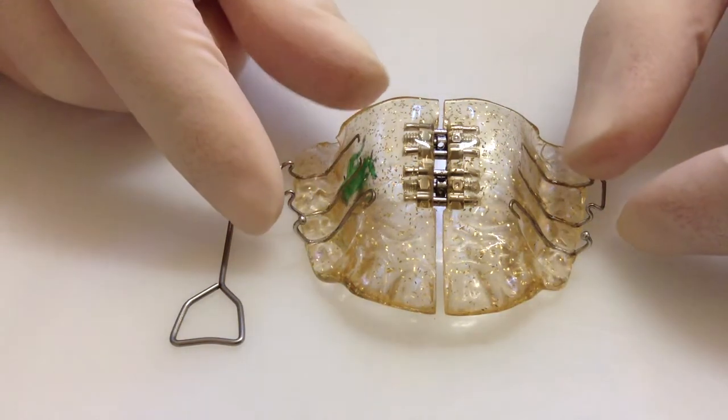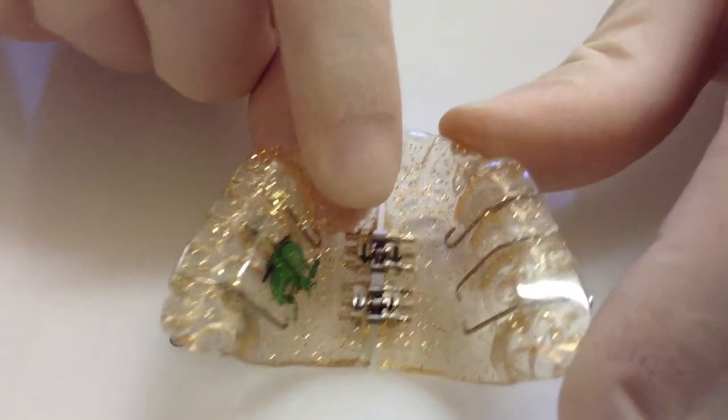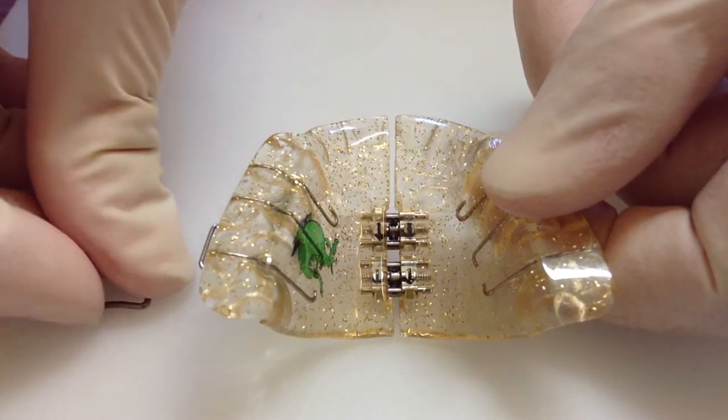This is a removable expansion plate. To expand your plate, make sure you always do it when it is not in your mouth, and only ever expand the parts of the plate that your orthodontist has instructed you to.